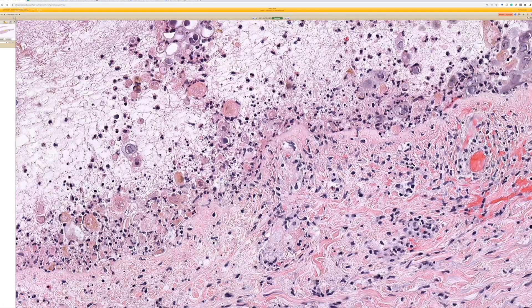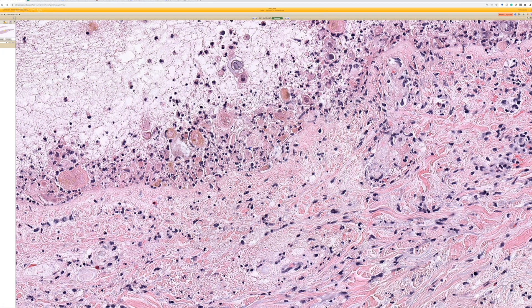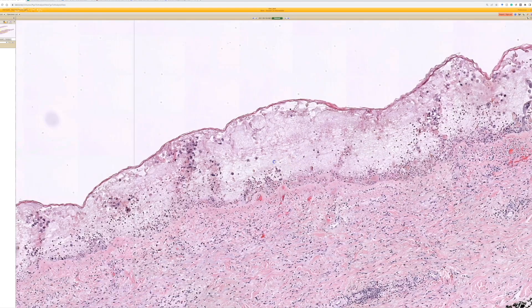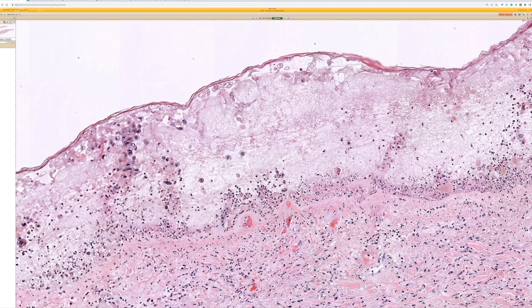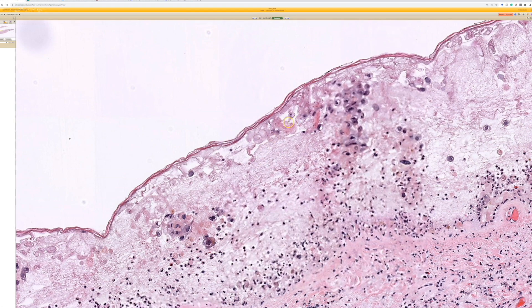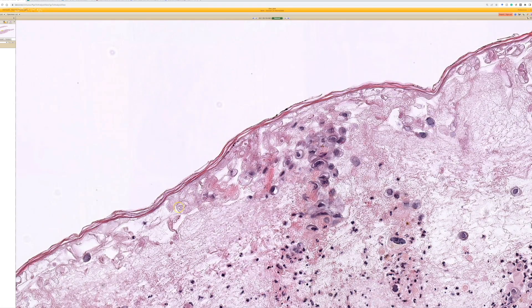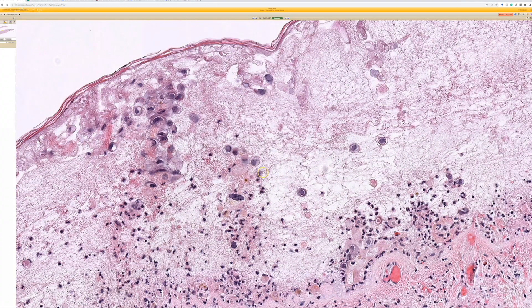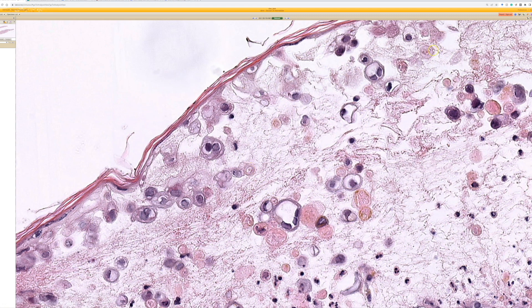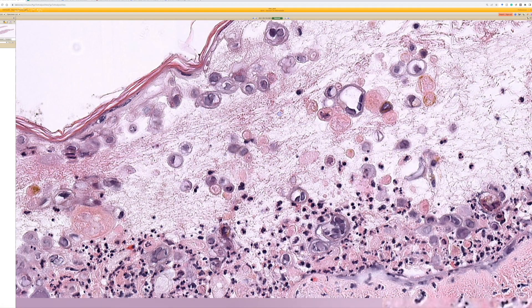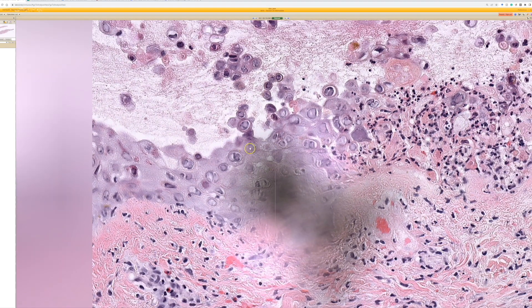And also dirty necrosis — I find that really helpful either in a blister with acantholysis or even just an open ulcer with no blister roof, because a lot of times they ulcerate by the time they're biopsied. It's only a minority of cases I get that have this beautiful intact necrotic blister roof. You can see the whole blister roof is dead, composed of necrotic cells with herpes viral effect — you're seeing the ghost of them. And sometimes you can see a nuclear inclusion; I feel like I see that better in the dead nuclei, like a reddish dot in the middle. Really nice example of herpes.